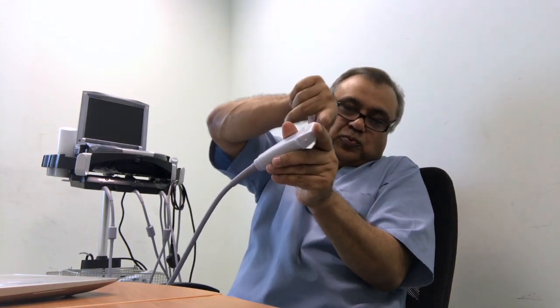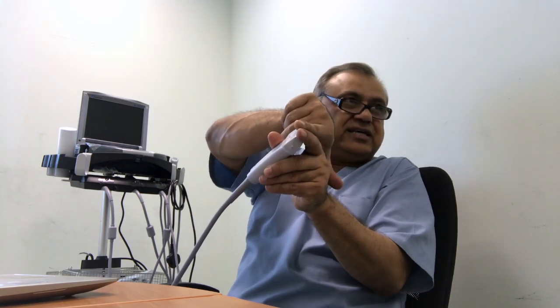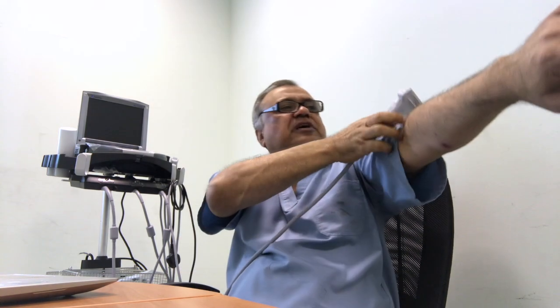If you try to penetrate, it will give you a little excess. You can go 1 millimeter, 2 millimeter, it will not enter the artery. But if you come straight, there are more chances. So it's theoretical also. But the ultrasound will not be the classic view. It will be different. No, it will be the same.